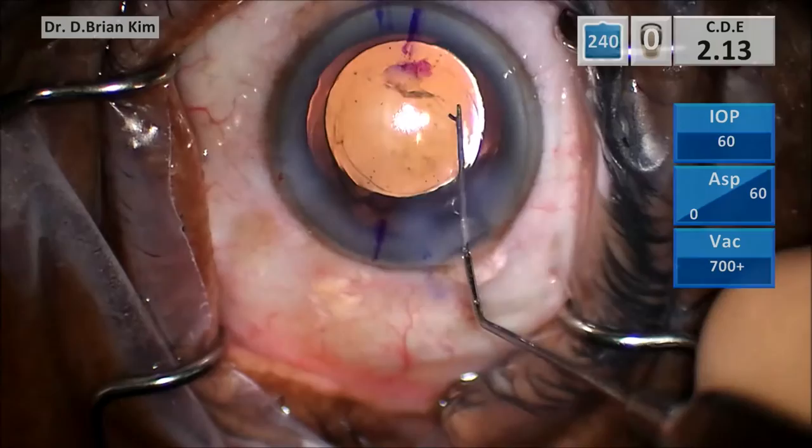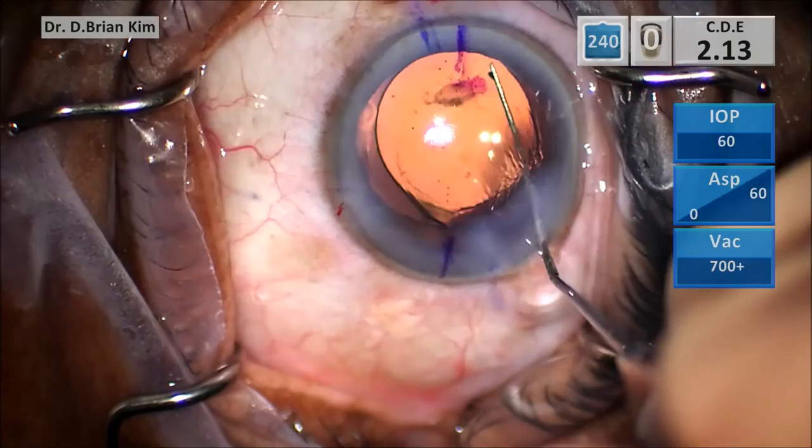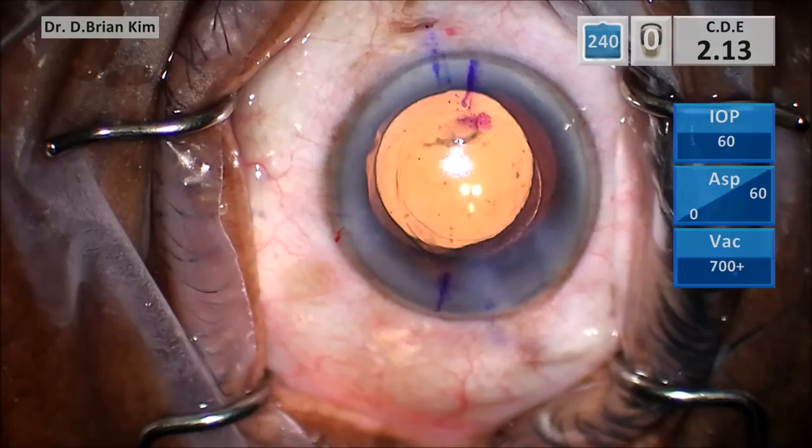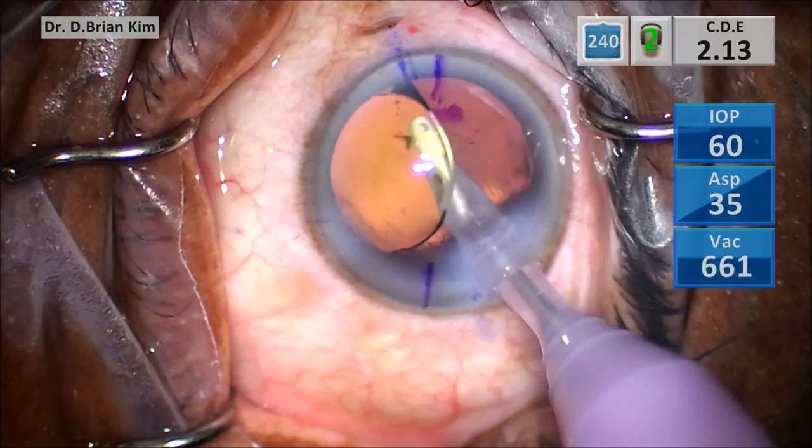Now, once the cornea is marked, I use a Maltzman instrument to help get the lens into the general ballpark. Because there is viscoelastic filling the capsular bag, it's okay to rotate the lens counterclockwise. You want to position the lens slightly more counterclockwise because the lens tends to rotate in a clockwise direction.